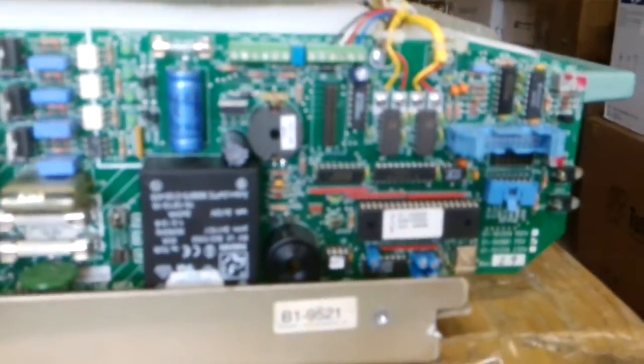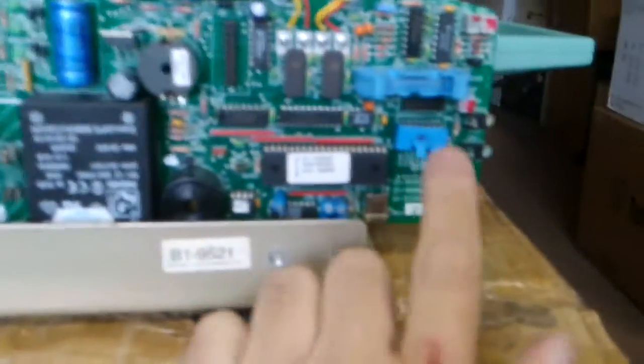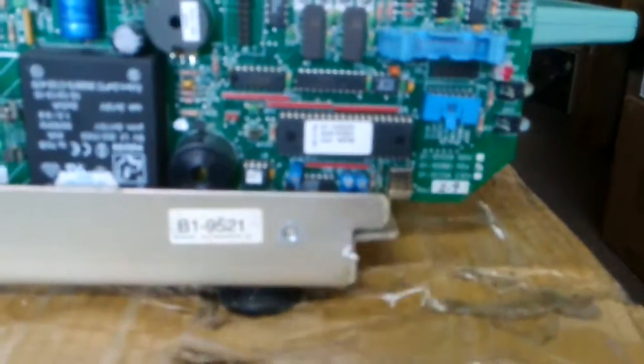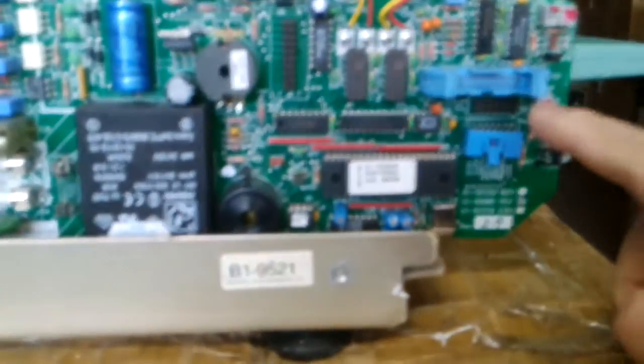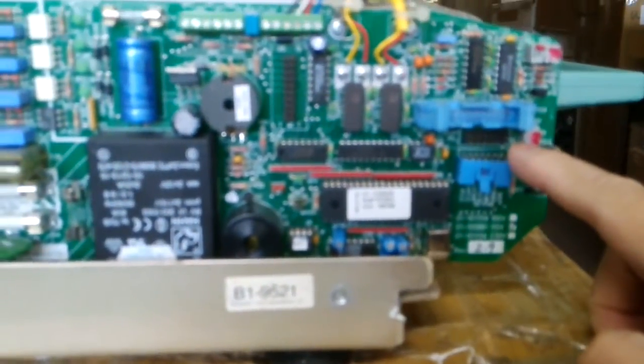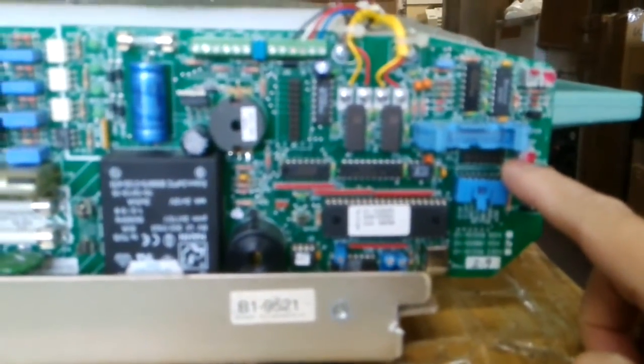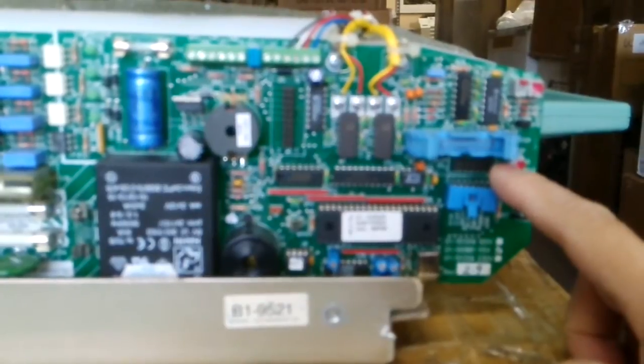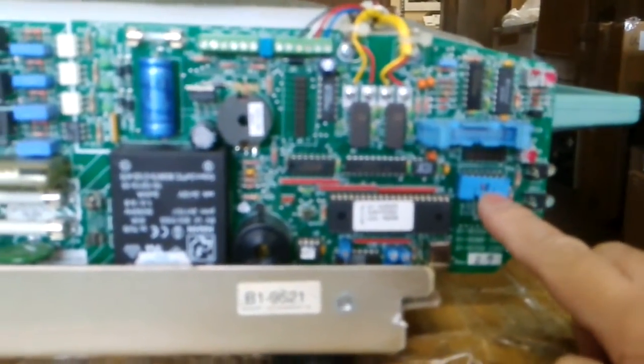There are two interfaces here. This interface goes to the control display board, and this goes to the switches.